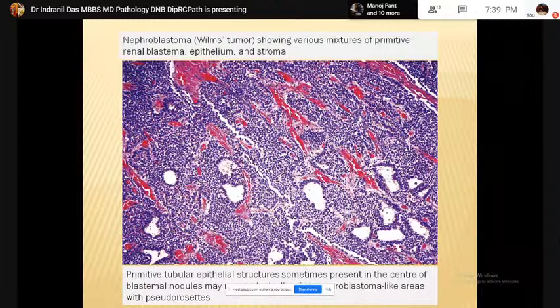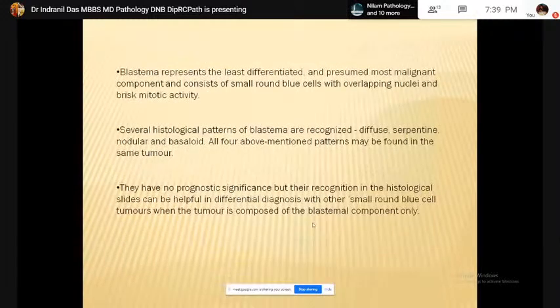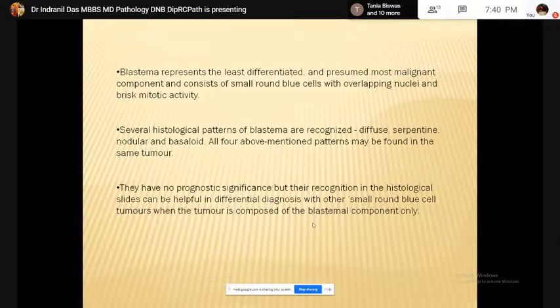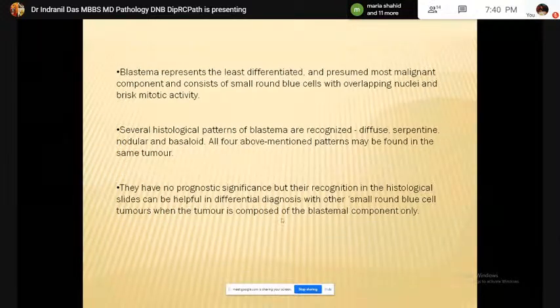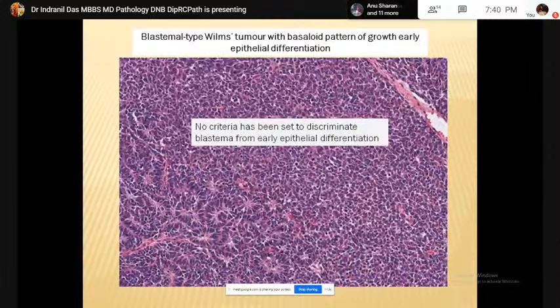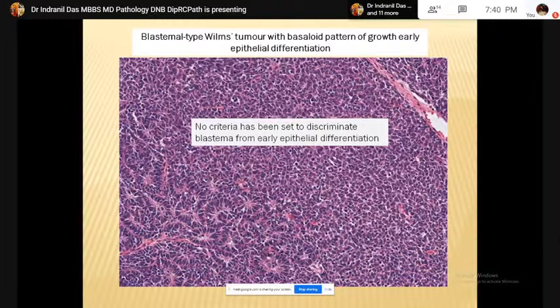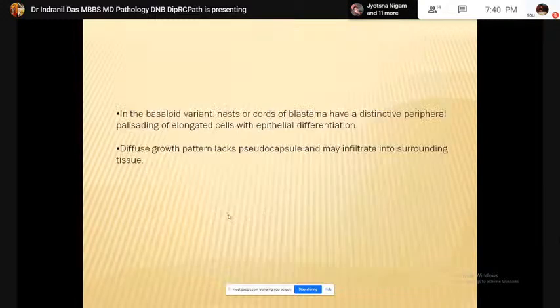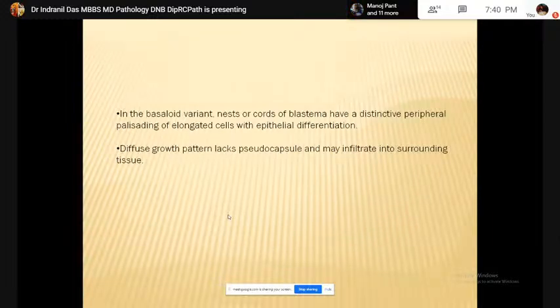The tubules may get confused with the rosettes of neuroblastoma, another common pediatric tumor. Features that favor tubules are central lumen, single layer of cell lining, the basal lamina, and surrounding fibromyxoid stroma. The blastema represents the least differentiated and presumed most malignant component. Several histological patterns of blastema are recognized: diffuse, serpentine, nodular, or basaloid. All four patterns may be present in the same tumor and do not have any prognostic significance.